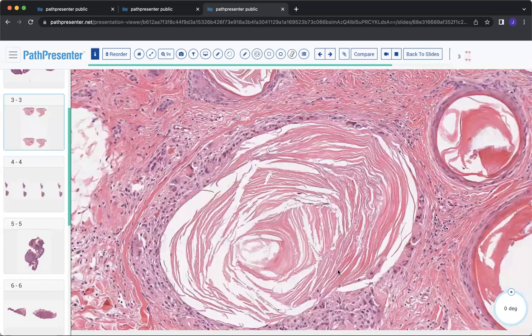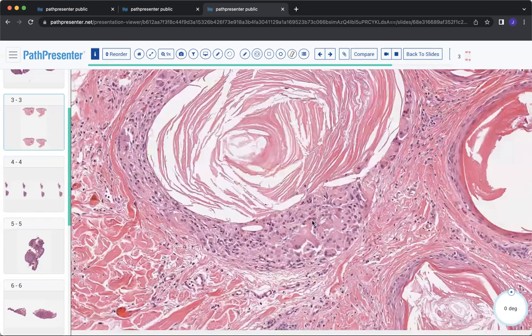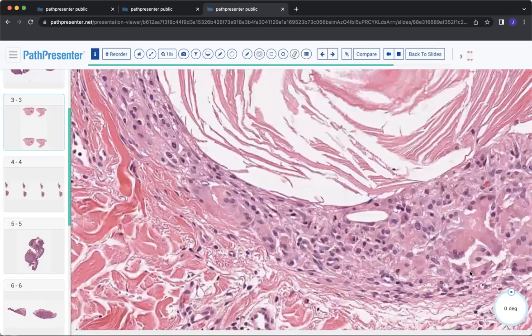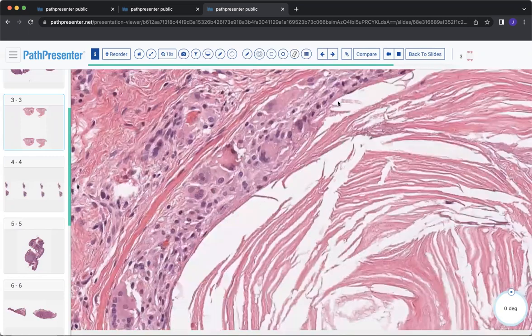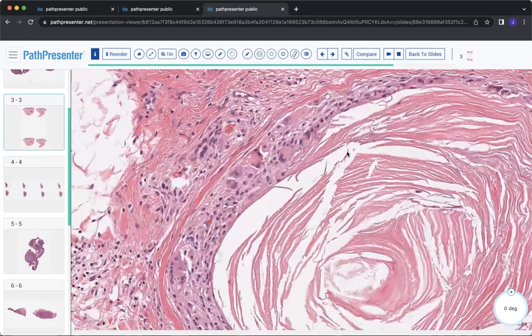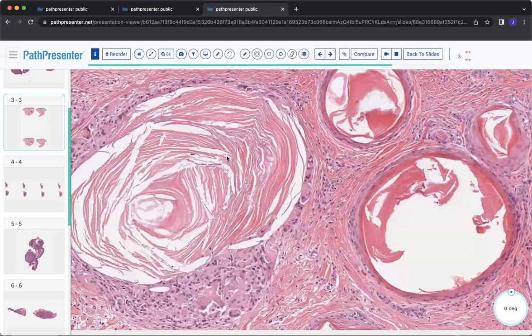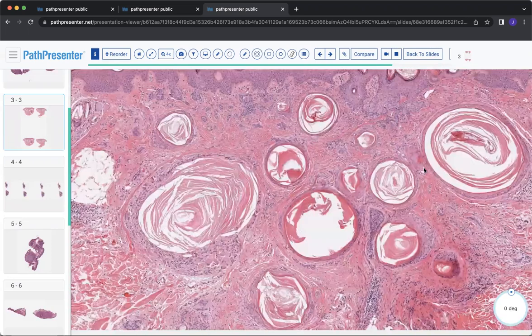Now, there does appear to be almost like a histiocytic population surrounding this. This is not, in my opinion, a keratinocyte population. This is a histiocytic population. You can see that they're forming almost like these little giant cells that you might get from or surrounding a ruptured keratin cyst. So, of course, this looks like a little small EIC or a little small milia. And so you can get that histiocytic population around these little cysts in a trichoadenoma.